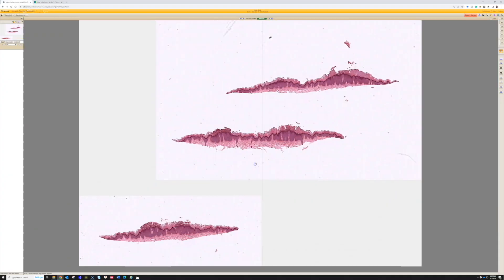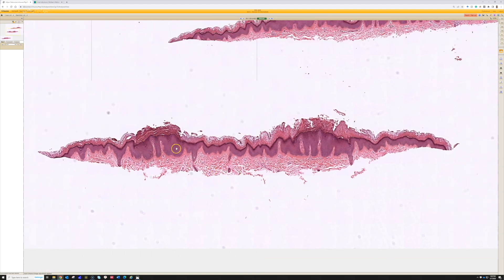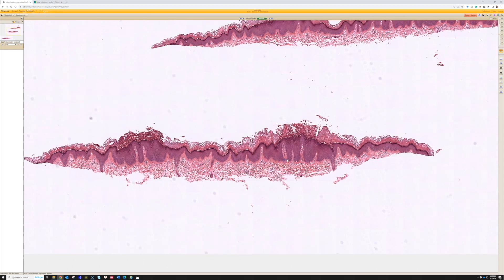Case number eight is a shave biopsy and I like this one because it shows two lesions. This disease is verruca plana, or flat warts. Verruca plana are much more subtle than verruca vulgaris — verruca vulgaris have prominent papillomatosis with finger-like projections, tiers of parakeratosis, and inward turning of the rete ridges. I've got a long in-depth video and a short video about verruca — links are down below.